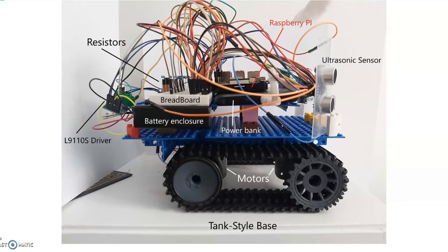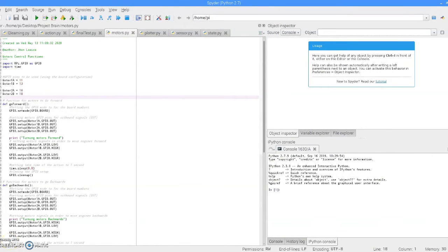To provide energy for the computer and the motors, 2 separate power supplies were implemented. For the computer, it was a power bank, and for the motors, 2 battery enclosures for 9V batteries. The next part of this explanation will be to guide you through the different files and functions that help to implement the learning algorithm for the device to learn by itself.